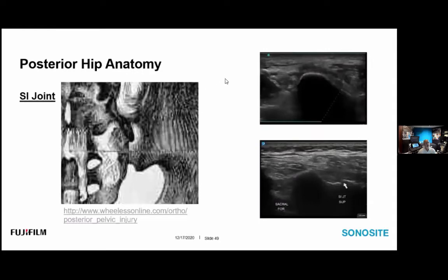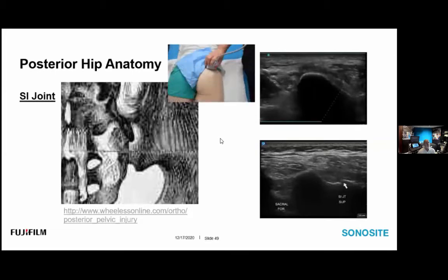The SI joint is a diarthrodial joint. Its sacral surface is covered with hyaline cartilage and the iliac surface is lined with fibrocartilage. It is smooth in the young and becomes irregular with age. It can become unstable due to ligamentous injury or laxity, resulting in instability and discomfort. Ultrasound can be the procedure of choice for therapeutic injection. We begin our examination at the posterior superior iliac spine with the transducer placed in a transverse body plane at the level of the PSIS.